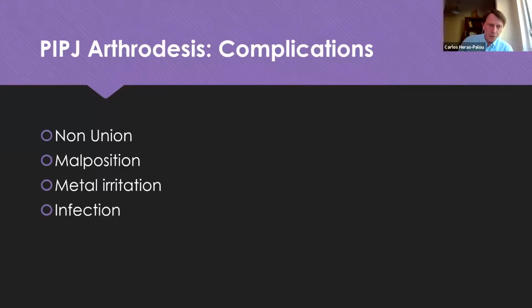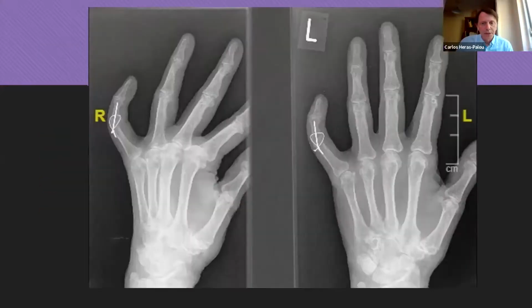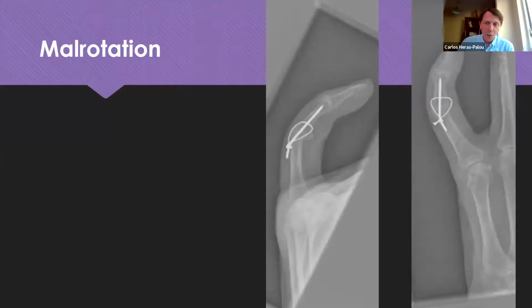So what are the complications of this? Non-union, it is rare, but it happens. Mal-union, this is one lady with a small little finger that had this arthrodesis, and that looks very good. It healed very nicely. However, it was mal-rotated, and what happened is that every time she flexed, the little finger got underneath the ring finger, and she was very distressed by that.